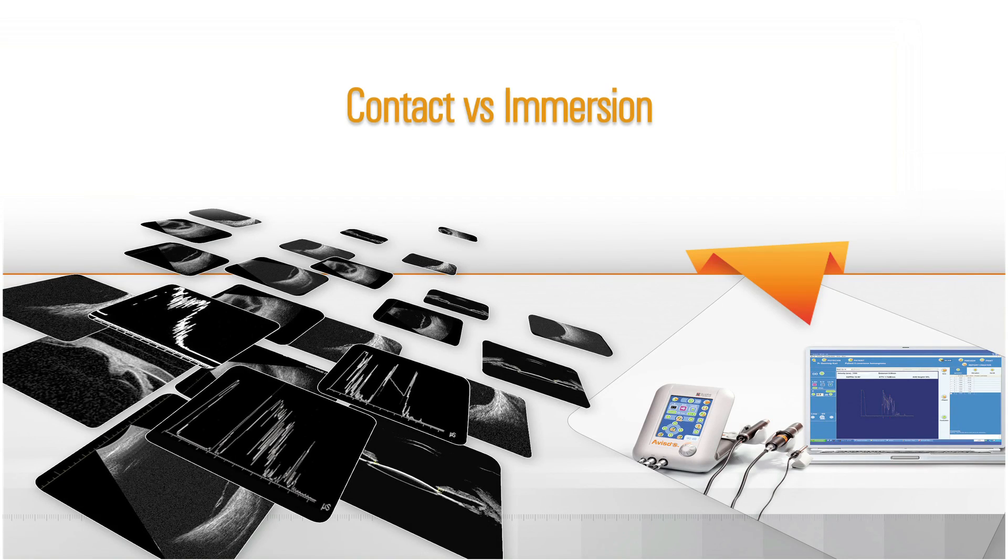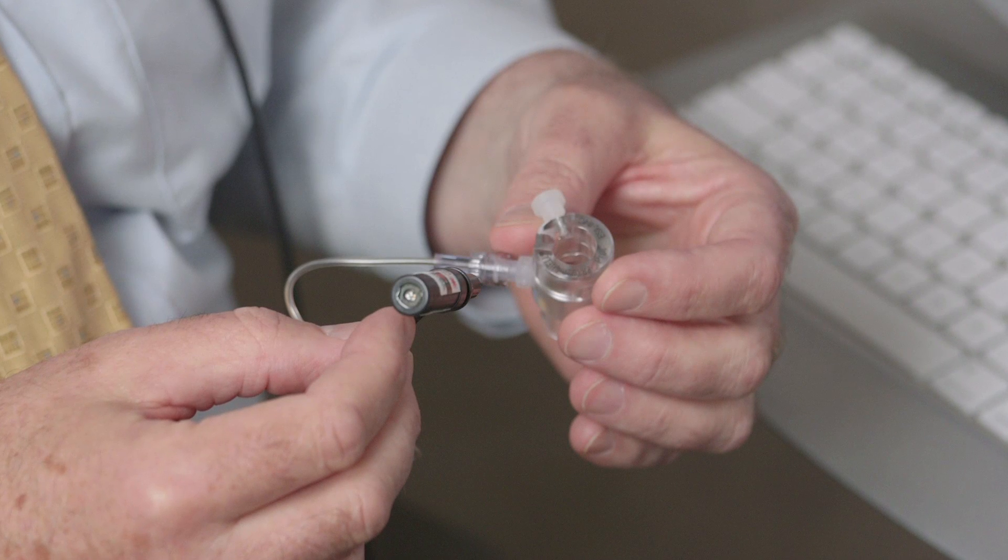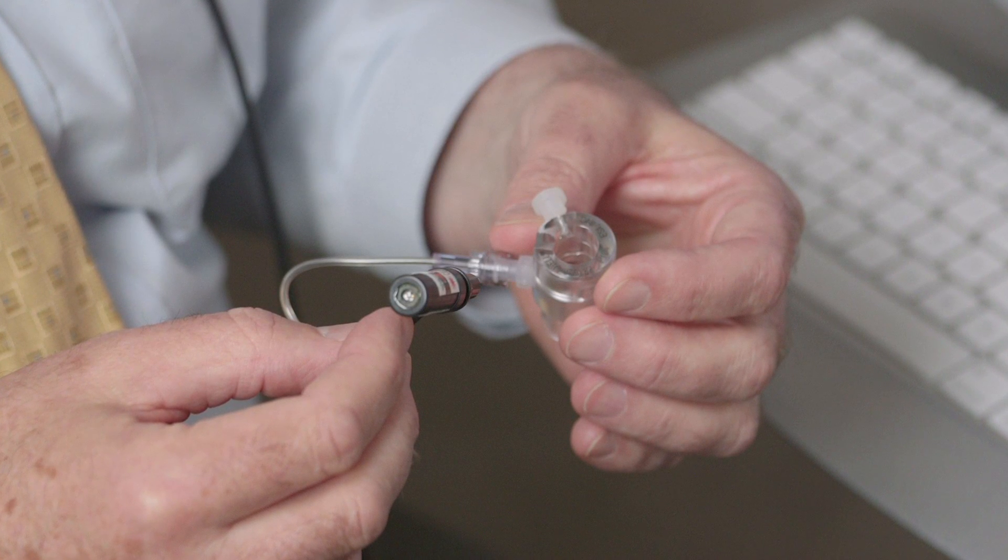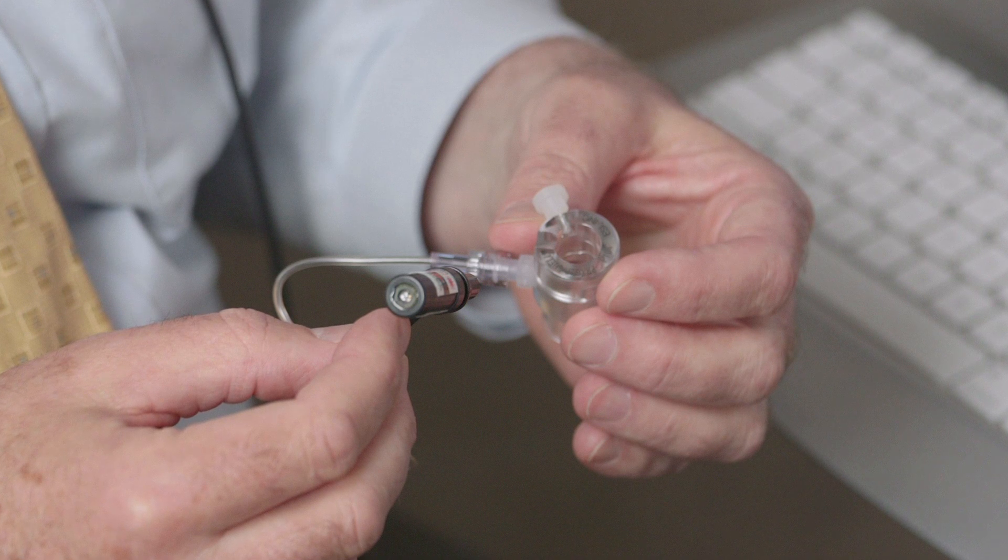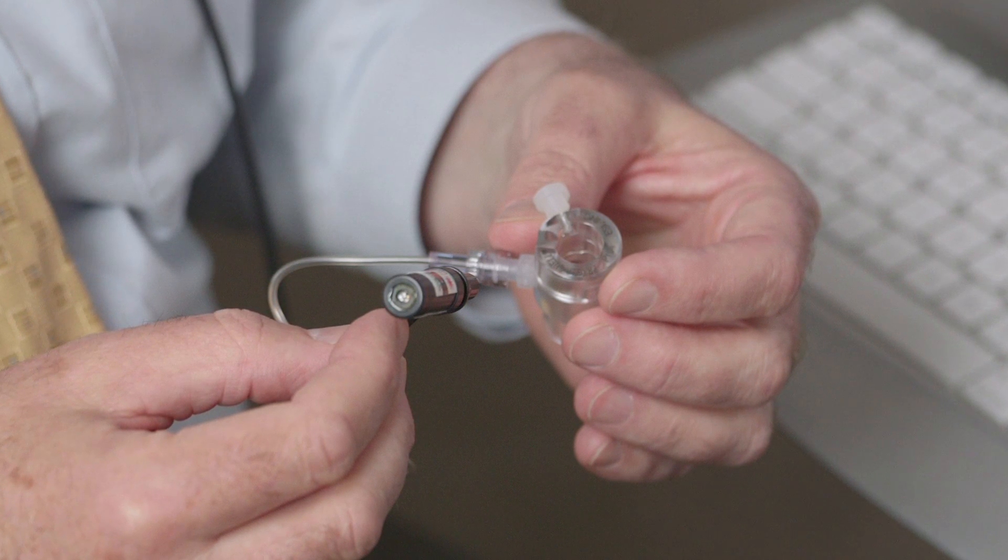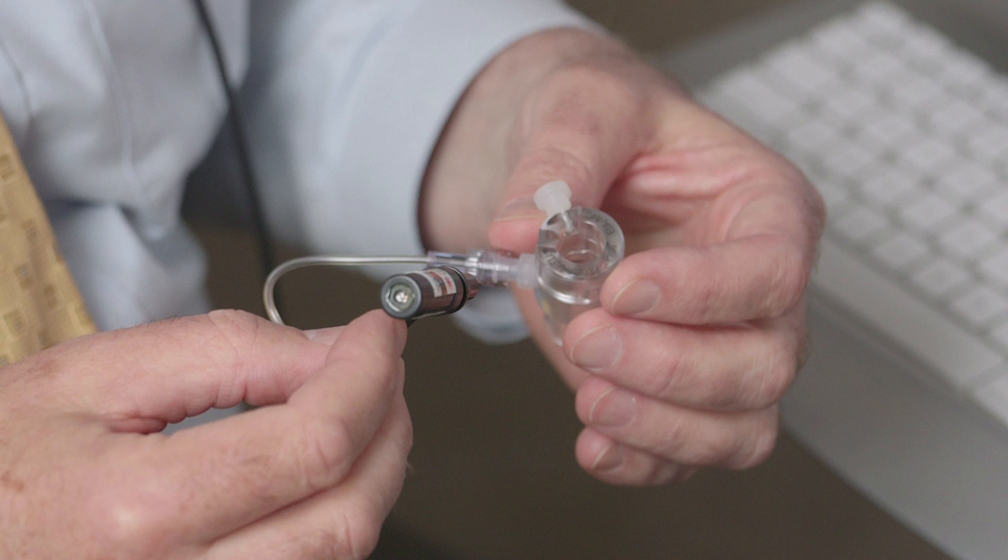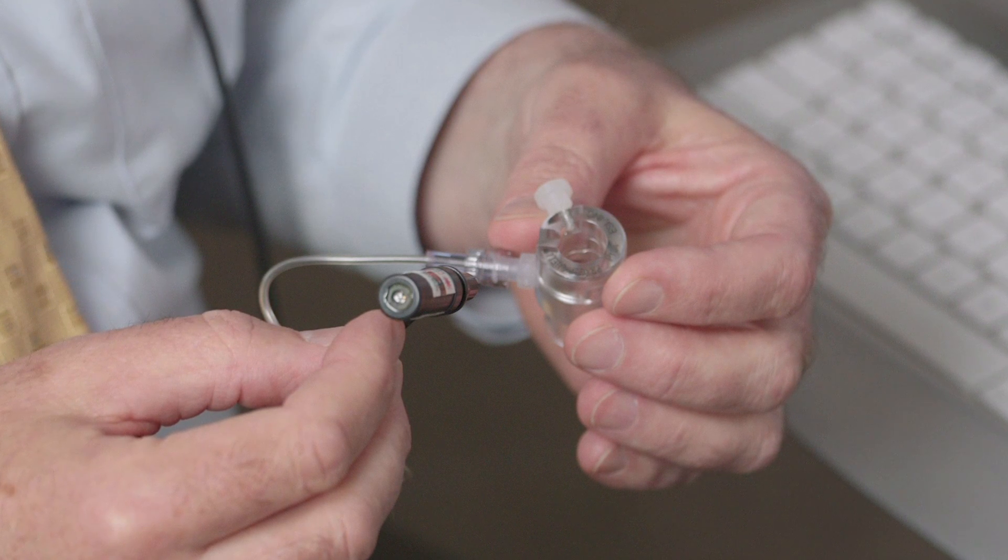Contact versus Immersion. For A-scan biometry of normal eyes, two methods of probe placement may be used. In the contact or aplanation method, the probe is placed directly on the cornea. In the immersion method, the probe is placed over the cornea in a fluid interface contained by a scleral shell.